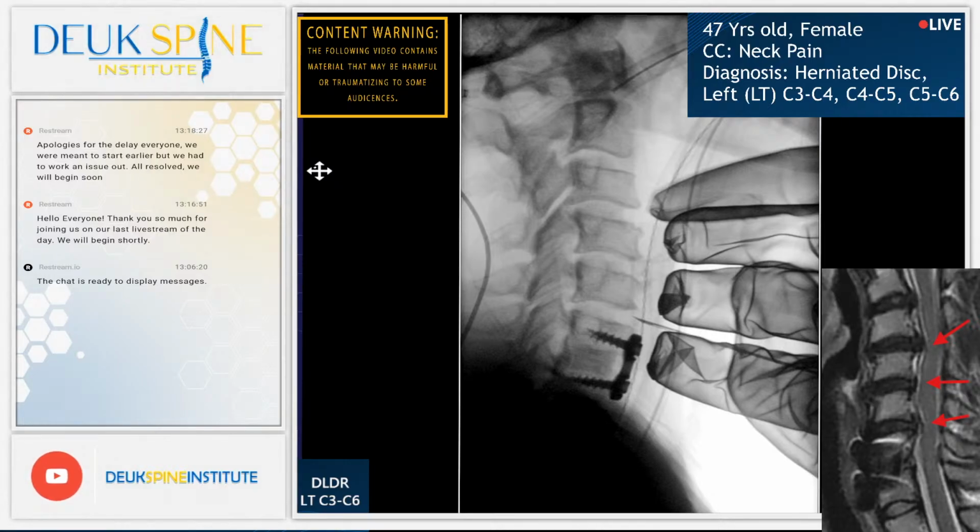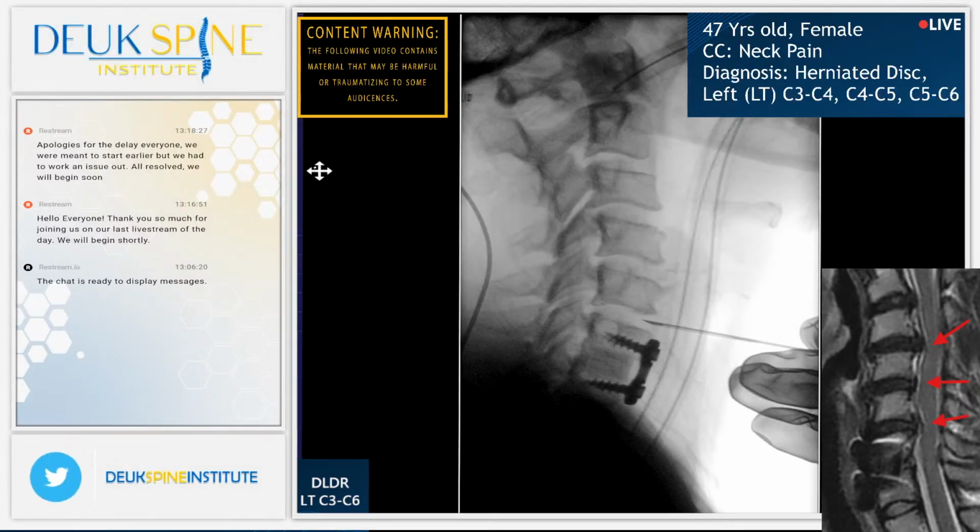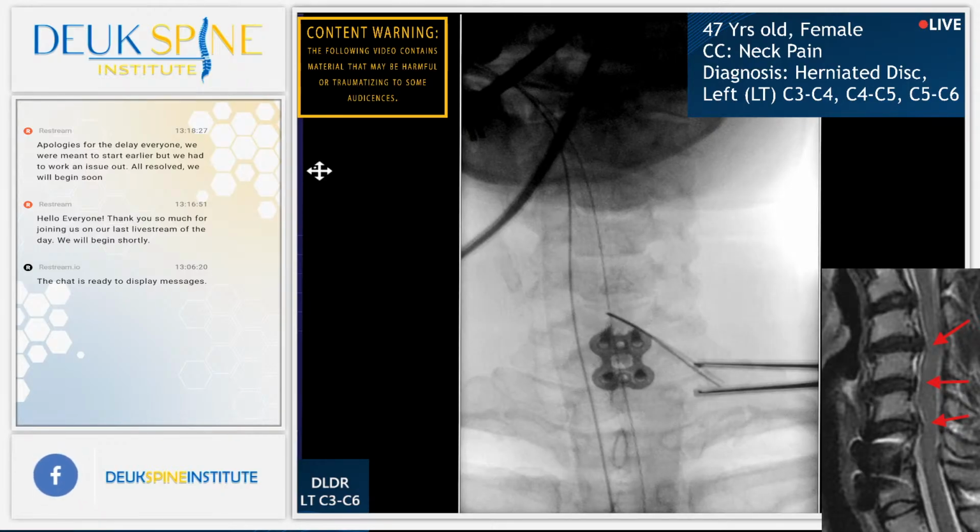And give me another AP. You all see the fusion, right? Metal plate, screws. Yes, we do. Good. All right, that looks good.